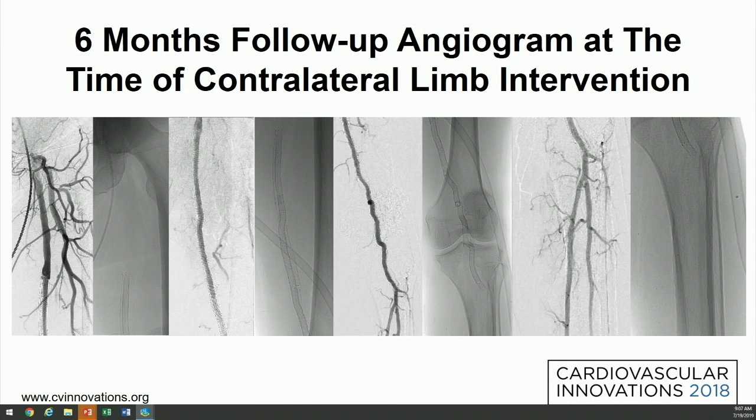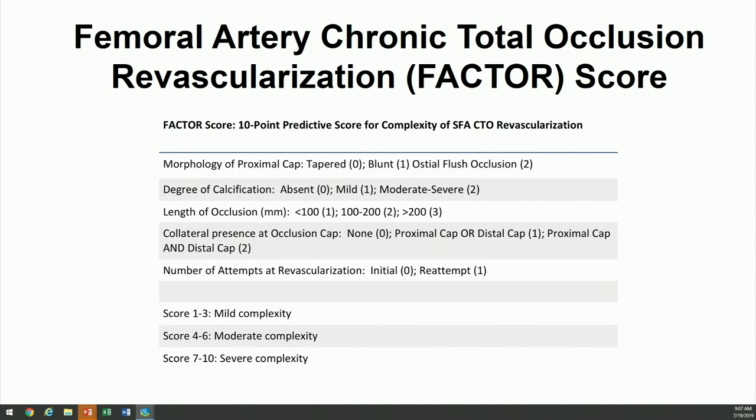And in the same setting, we took pictures of his index leg, and that shows that our stented area remained patent with some elongation in the stents, which we kind of expected with the high stackability that we did. But we maintained 3-vessel runoff into his leg. And so this is data from our own institution.